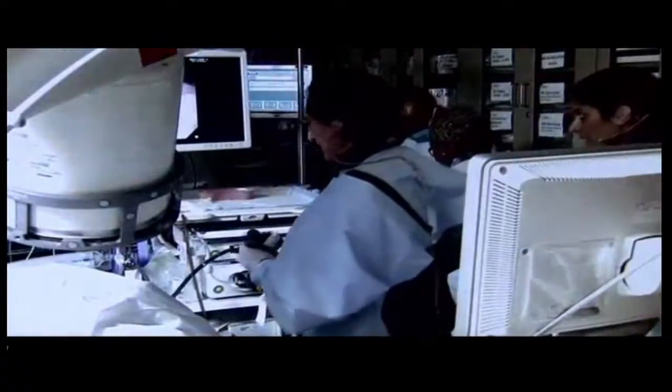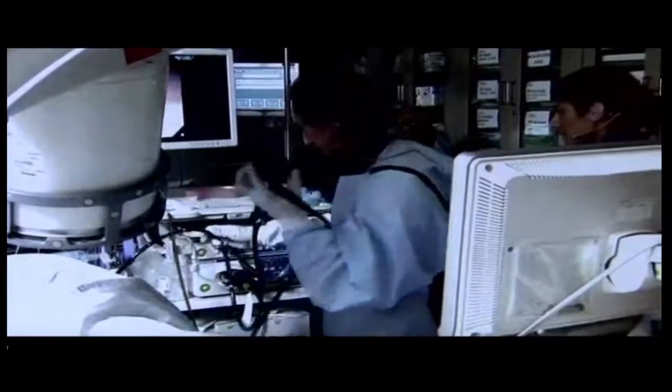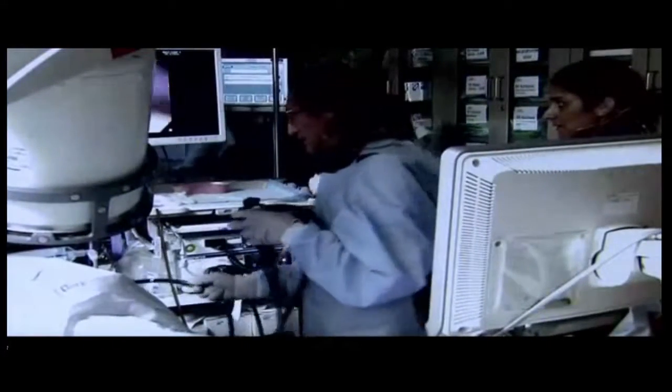Are we going to send that for cytology? Yeah, I think we are going to, even though she's had numerous sampling of her bile duct, I found in the past that there's actually quite a lot of tissue that comes sometimes with these fully covered stents when you remove them.